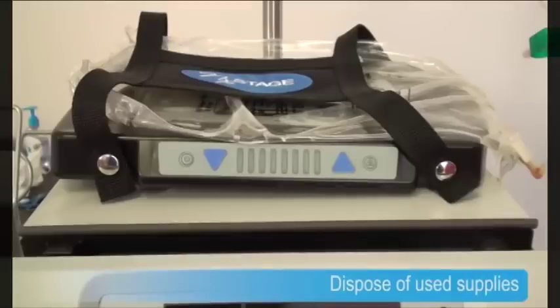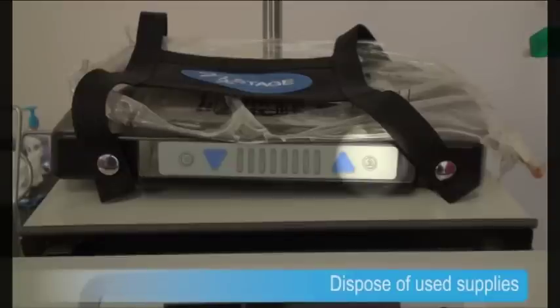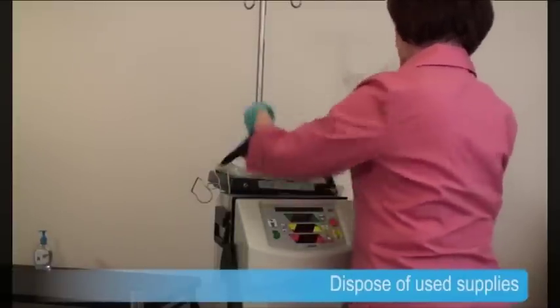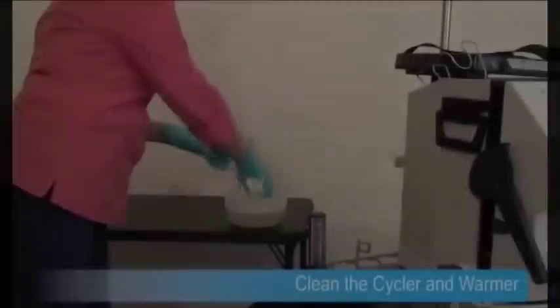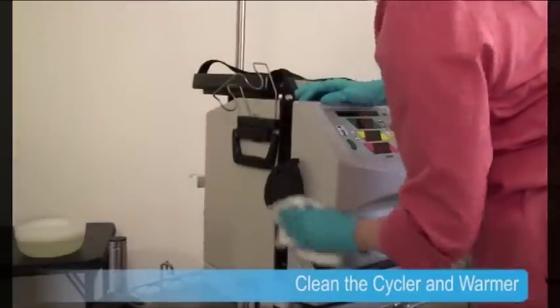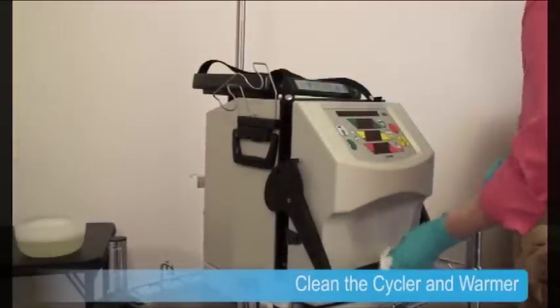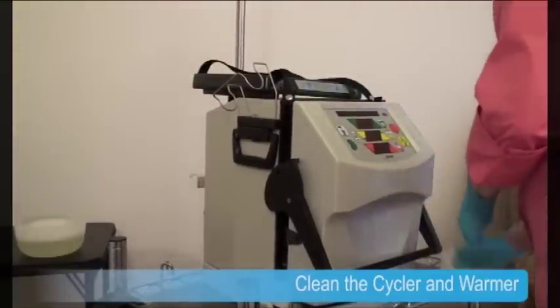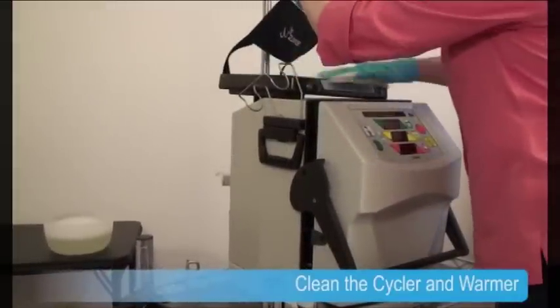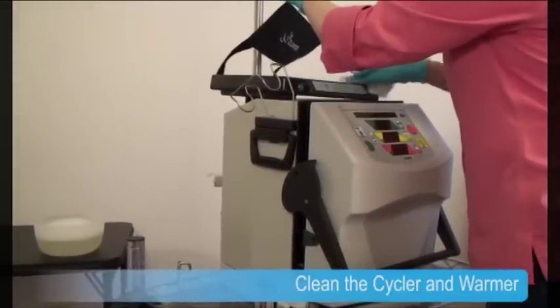Lois cannot remove the bag from the warmer until the hot surface light is off, to prevent possible burns. Finally, she cleans the outside of the cycler and warmer. She makes sure the cycler door is closed, then uses a paper towel and a mild detergent to clean the cycler and warmer. She makes sure that none of the liquid gets inside the cycler as she cleans.